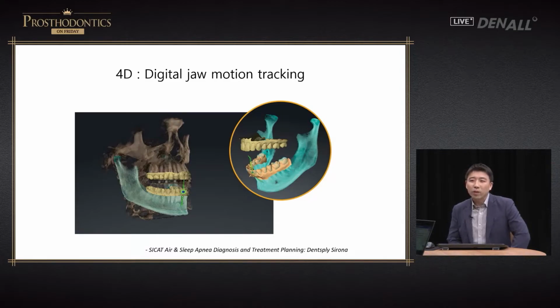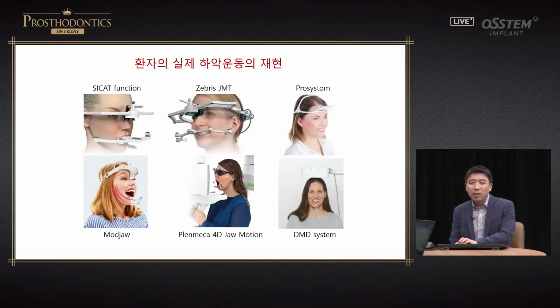Jaw motion tracking needs to be added to have a complete 4D patient. 4D virtual patient is what I want to call this. I'm really interested in the jaw motion tracking, and so are a lot of other people. As you can see, the equipment is too big, it's too bulky. It's kind of difficult to ask a patient to try this. The process is quite complicated as of yet.